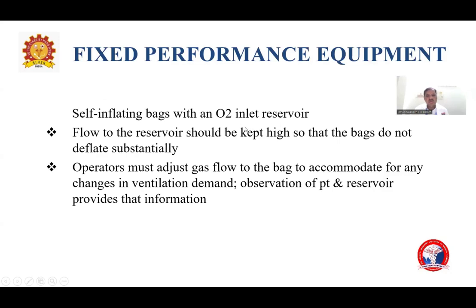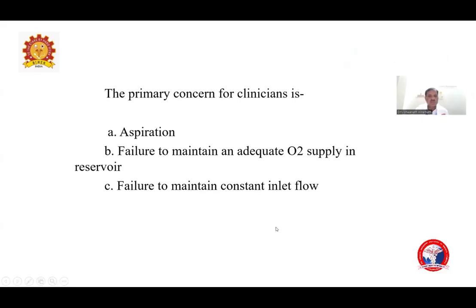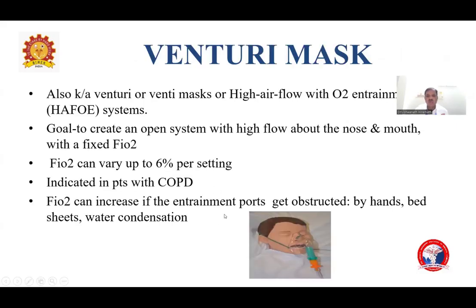Self-inflating bag with an oxygen inlet and reservoir. The flow to the reservoir should be kept high so that the bag will not deflate substantially. The operator must adjust the gas flow to the bag to accommodate changes in ventilation demand, observing the patient and the reservoir. Primary concerns: aspiration, failure to maintain adequate oxygen supply in the reservoir, and failure to maintain constant inlet flow.